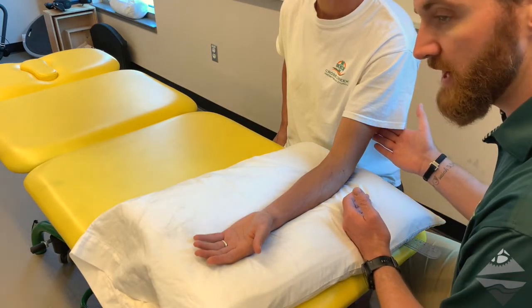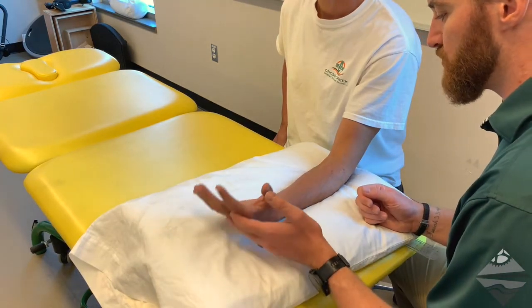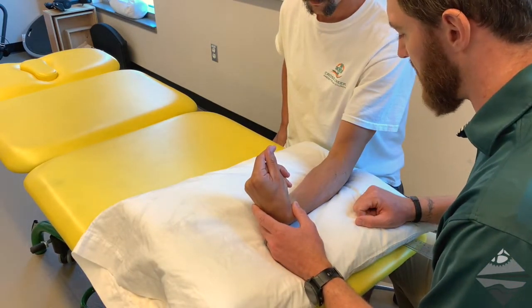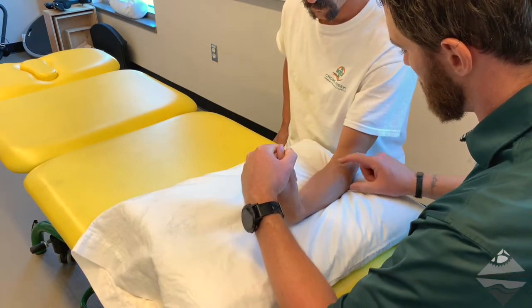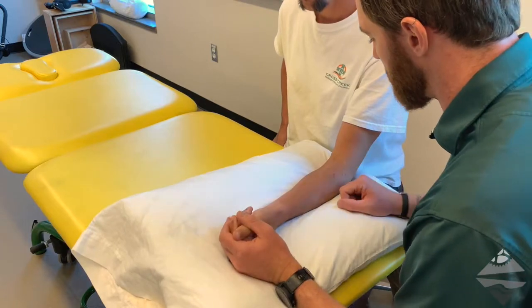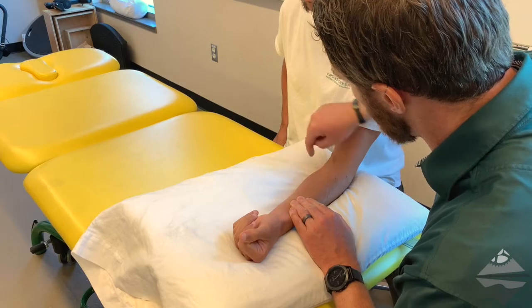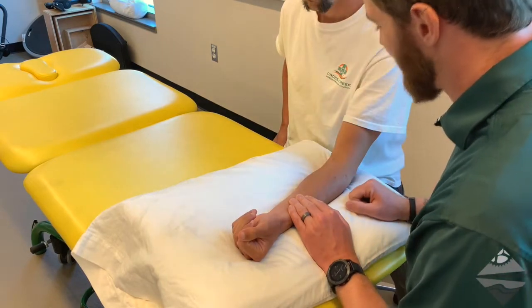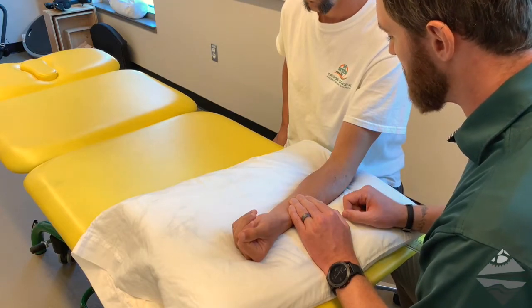We also have on the posterior aspect our triceps, and then as we move into the forearm, if we have the individual go into wrist flexion, we are going to initially give our focus to the medial side of the forearm. We can provide a little bit of overpressure, and you can see the appearance of our brachioradialis as well as our common flexors — flexor carpi ulnaris being the main flexor of the wrist — inserting into our common flexor tendon on the medial aspect of the elbow.